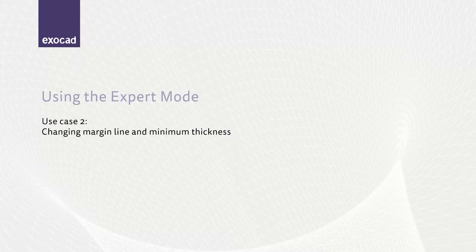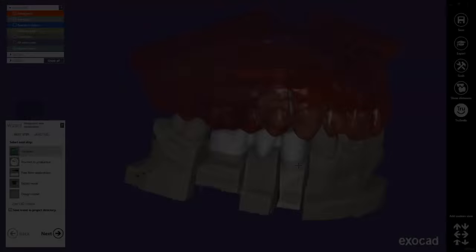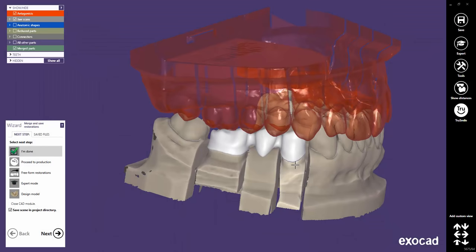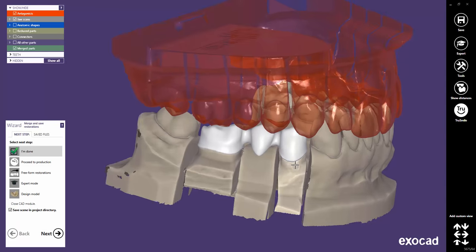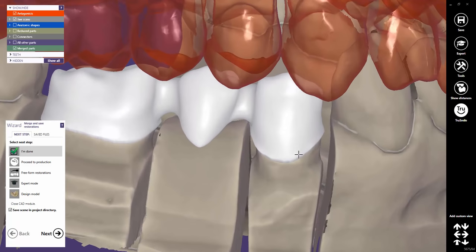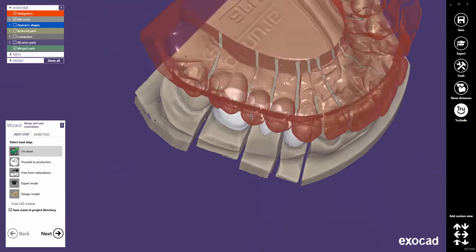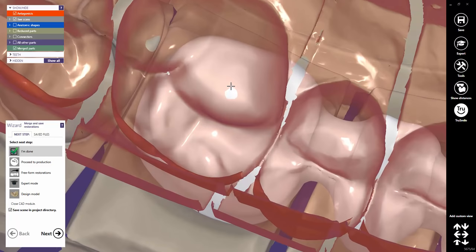Let's try another very interesting case to demonstrate a more complex operation: changing the margin line and the minimum thickness in a finished design. Imagine you want to change the margin line for tooth 24 because, for instance, you have decided afterwards to create a collarless ceramic crown. Or imagine you have discovered on tooth 26 that there is not enough space for the ceramic, and you'd like to change the minimum thickness.